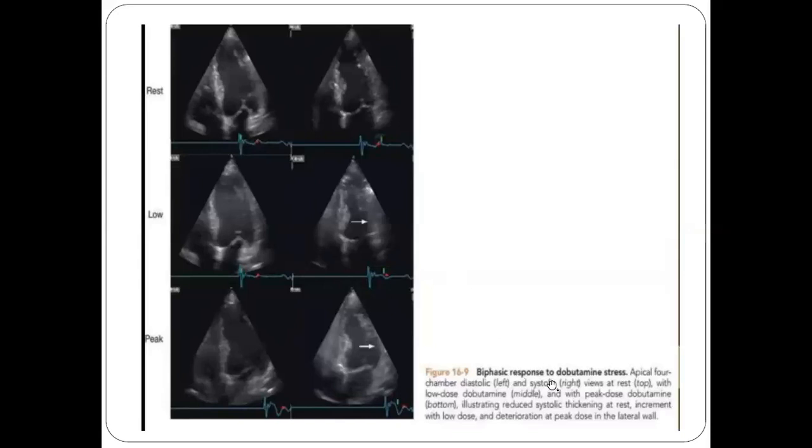You can see there is a biphasic response to Dobutamine stress. There is reduced systolic thickening at rest, improvement with low dose Dobutamine, and deterioration at peak dose in the lateral wall. At first, with low dose, there is increased movement, but with a higher dose there is again complete akinesia of this part.